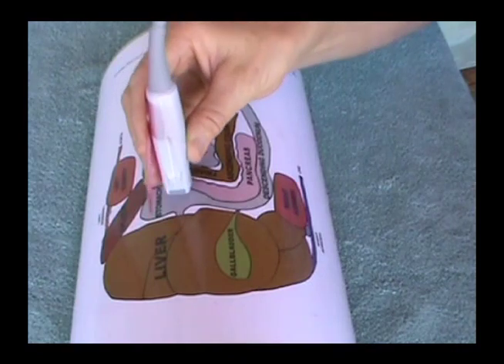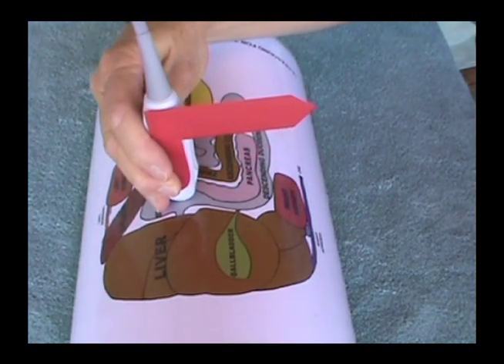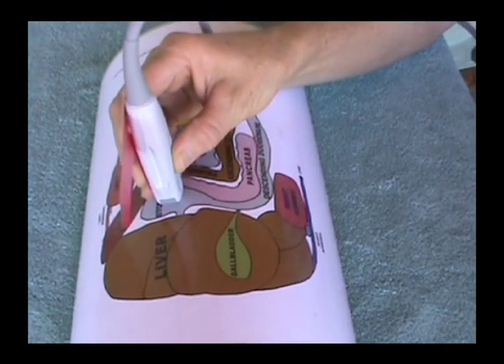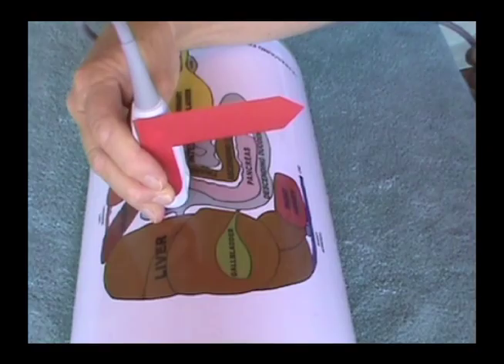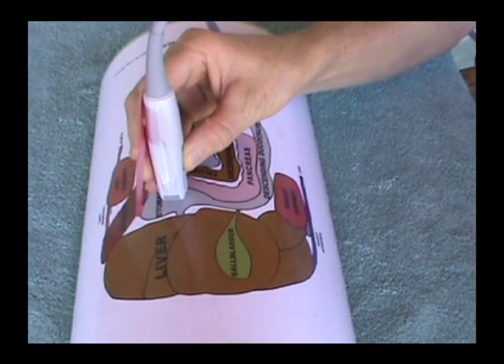The transverse plane is a cross-section of the patient's body. To obtain a transverse view of the stomach, rotate the transducer 90 degrees counterclockwise from the sagittal plane. When the transverse exam is completed, rotate 90 degrees clockwise back to a sagittal plane.